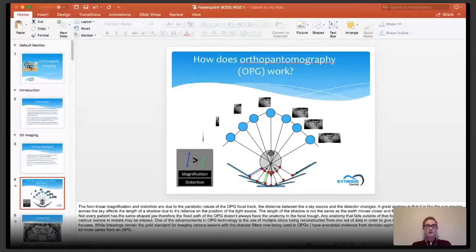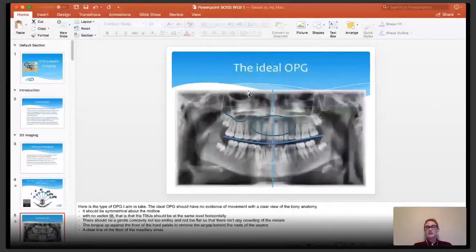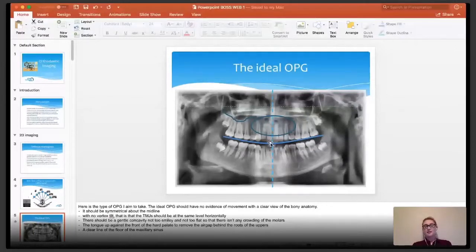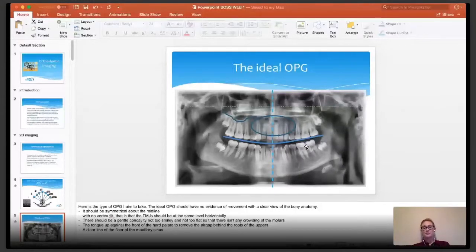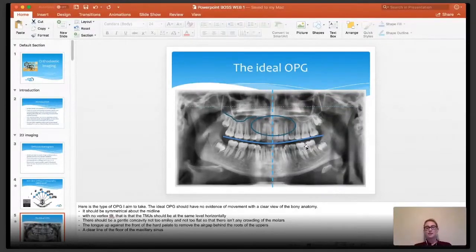It's restricted by superimposition because not every parabolic arc matches every patient — it's not a one-size-fits-all fix. As it travels around the patient in a parabolic arc, it changes the distance between the source and the detector, and that's how we get that magnification and distortion. An ideal OPG should have the TMJs at the same height, be symmetrical about the midline, have a nice smile arc, with the tongue up behind the hard palate to eliminate that air gap. There should be a nice bold outline of the maxillary sinuses.